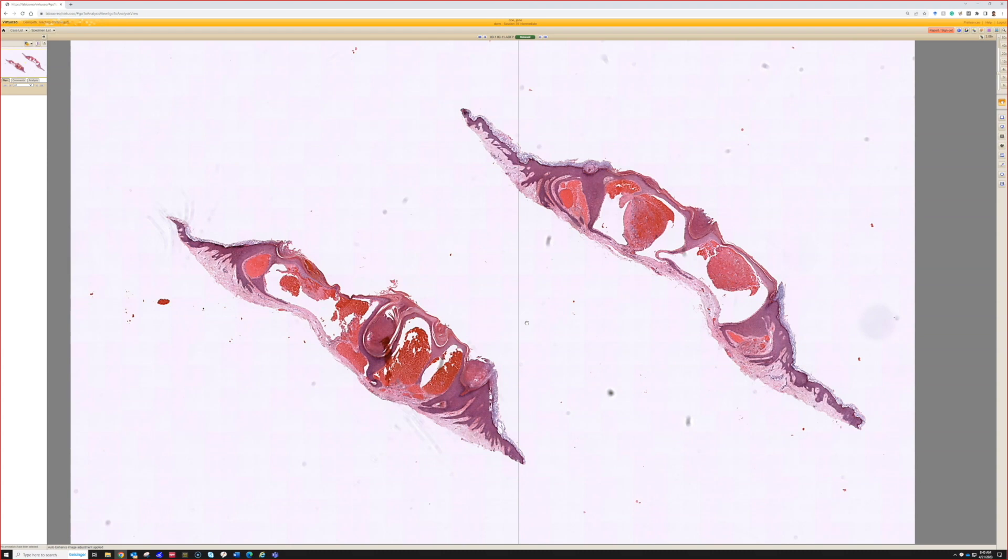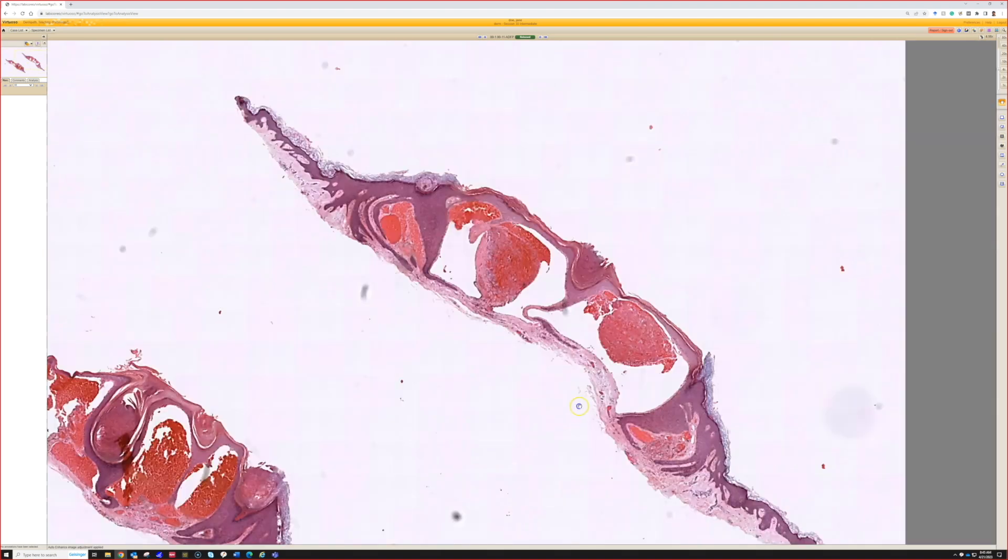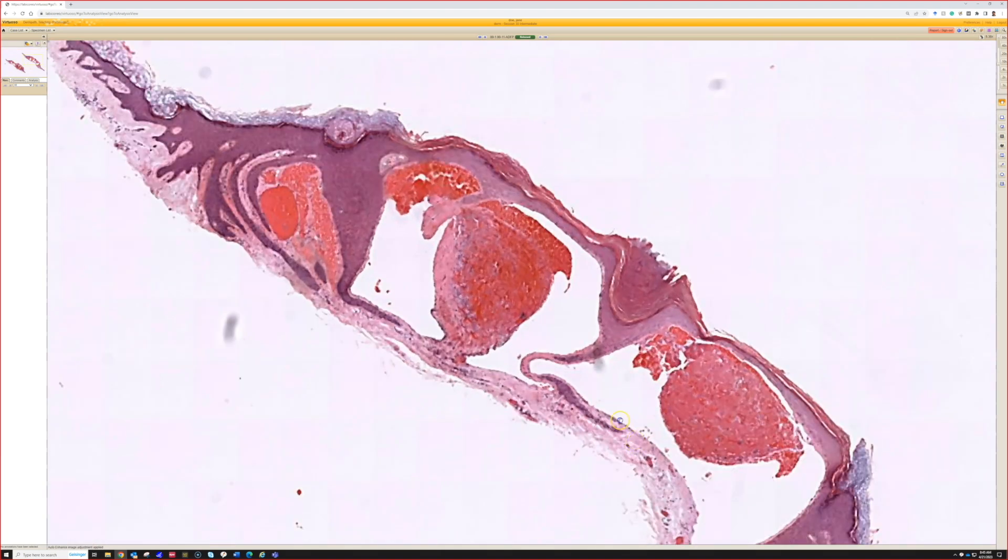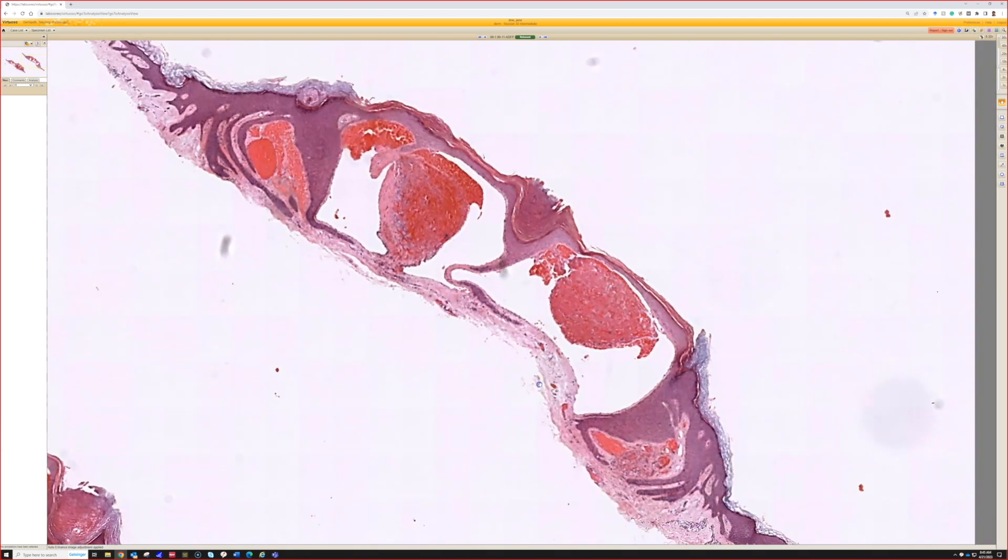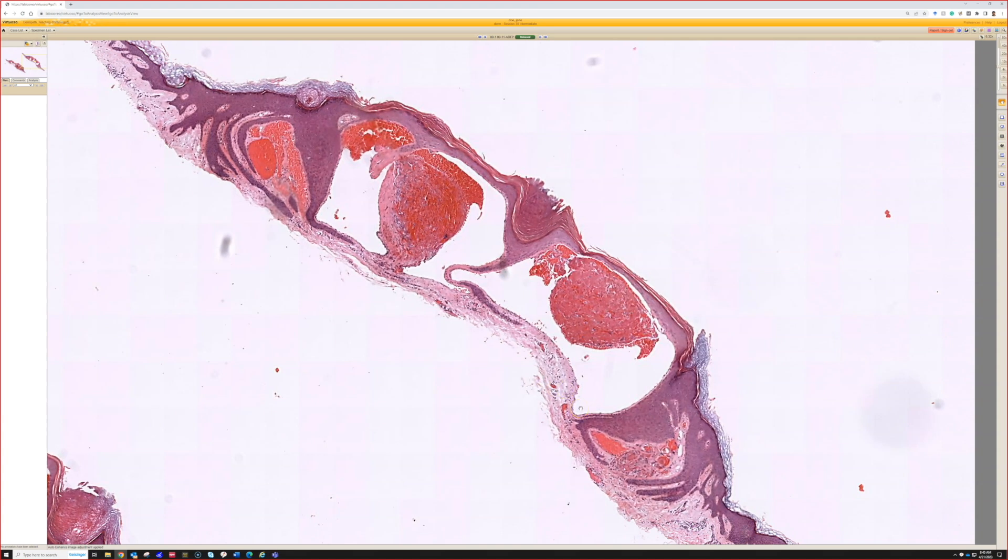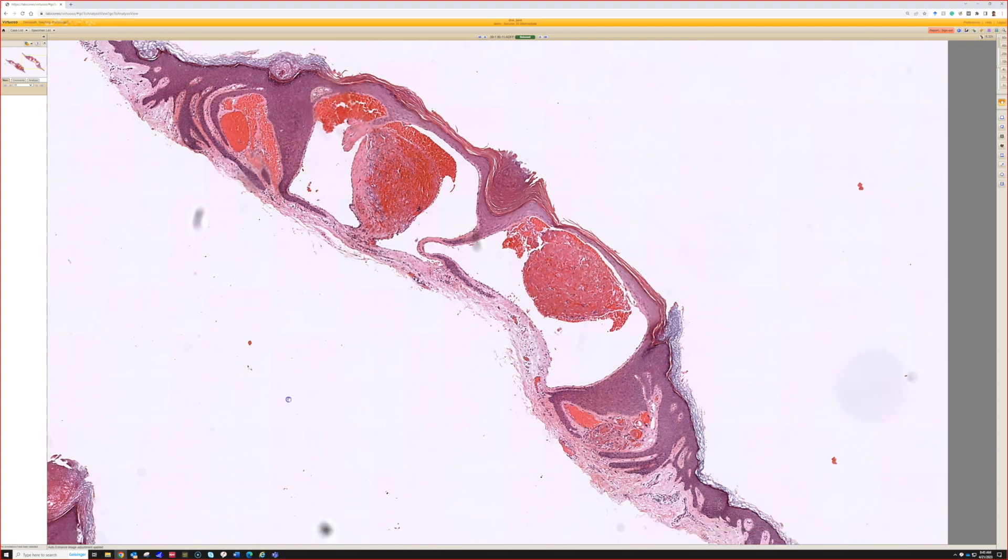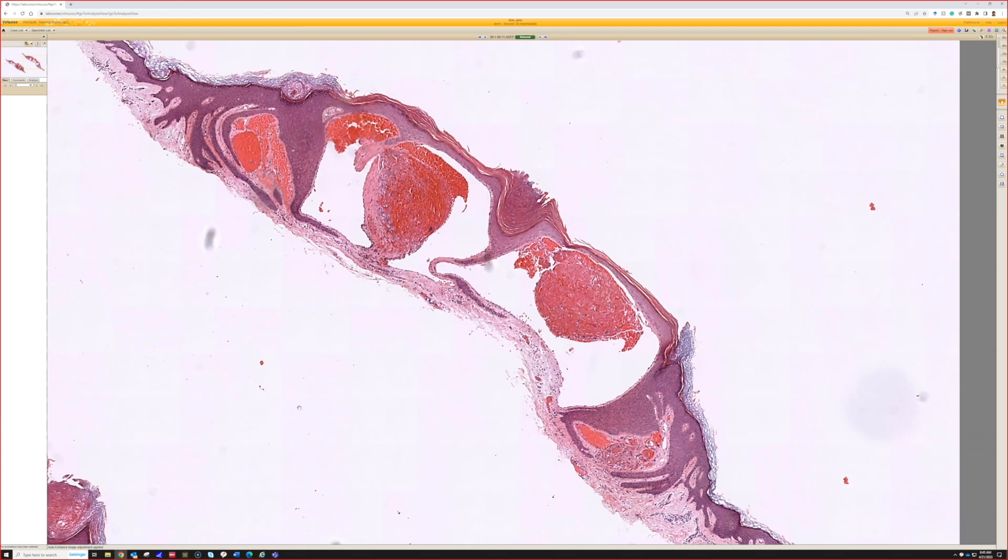All right, so another shave. This one, you know, we can think of when we were talking on the first slide about the targetoid hemociderotic hemangioma, how that one was different because it didn't have these long areas of the epidermis surrounding the vessels, which is what we see here. Whenever I see these, I think of fetid hemangioma, so I think angiokeratoma is good for this one.